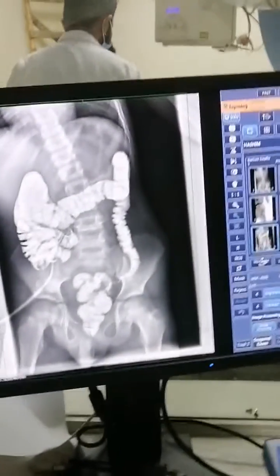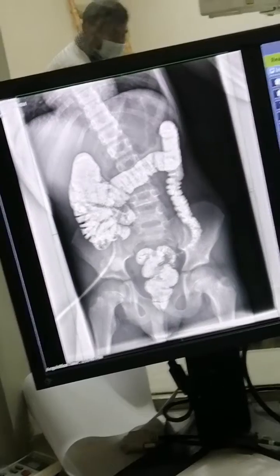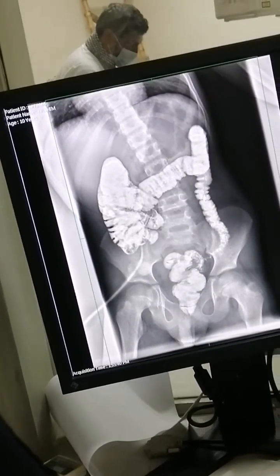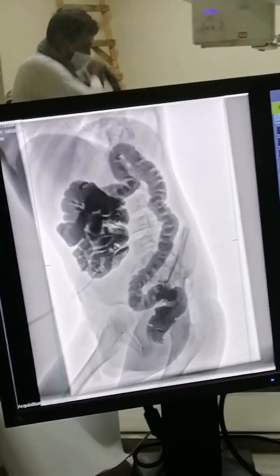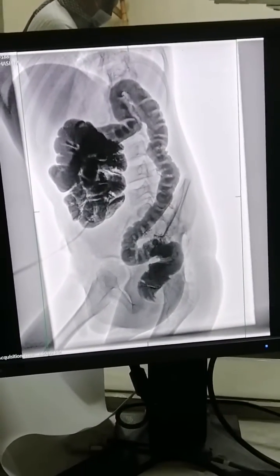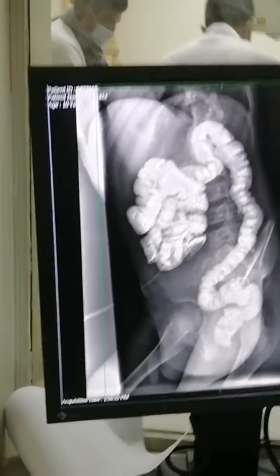After three months of the loop ileostomy, the surgeon performs the reversal of the loop ileostomy, which is a procedure done following the initial loop ileostomy.